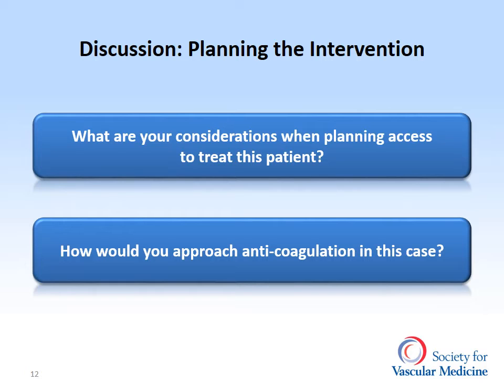With respect to anticoagulation, unfractionated heparin may be preferable. One can titrate the ACT during CTO crossing so that it is lower at this stage, but higher thereafter. Again, unfractionated heparin can be reversed in the case of perforation.